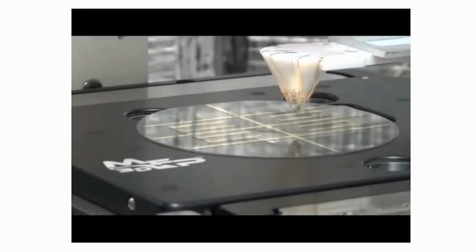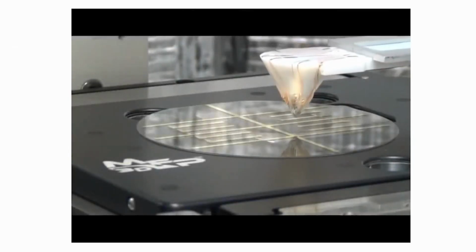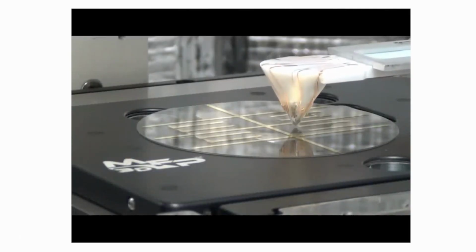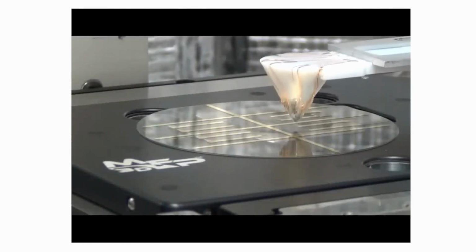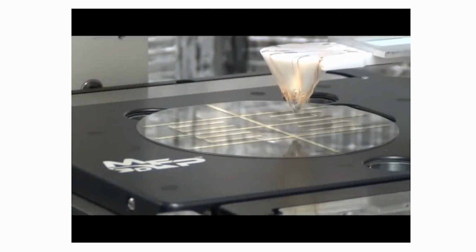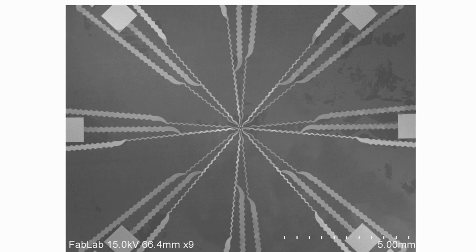Now, when you load the device, you can see with the help of a micro manipulator we are indenting the tissue, right, it goes down, it touches the tissue, indents it, gets the data, comes back. So, with the help of this we can measure the electrical and mechanical property of tissue. Now, you can see here this is a SEM image and is about 5 millimeter.